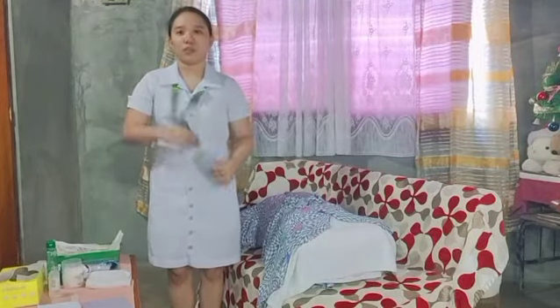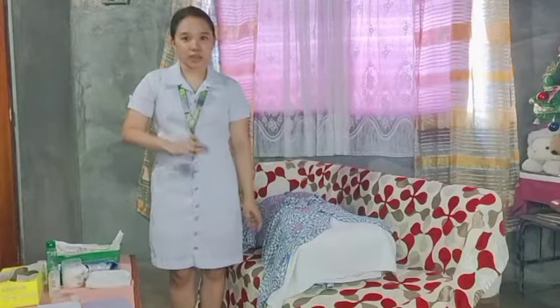Kyla Bruno, and for today I'm going to demonstrate to you how to do the proper procedure on how to insert and remove a female catheter and also getting the urine sample.